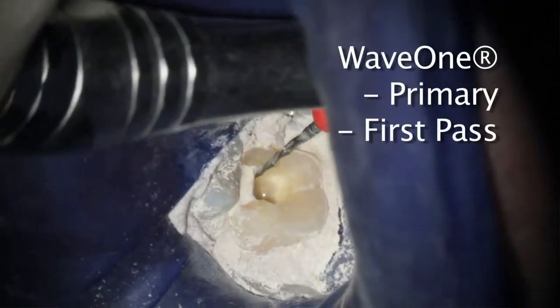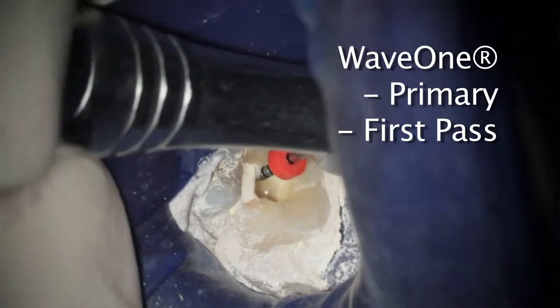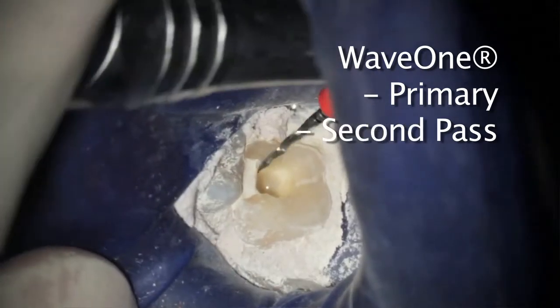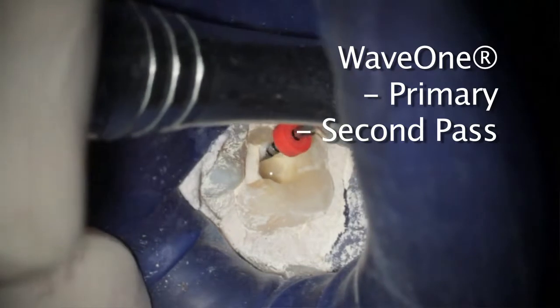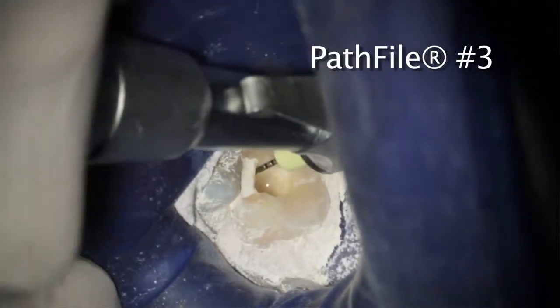The WaveOne file is inserted into the canal. The WaveOne is advanced apically 2 or 3 times and then removed from the canal and inspected. After removal, wiping, and inspecting, the WaveOne is introduced back into the canal for a second pass. I can't put enough emphasis on the need for maintaining patency.